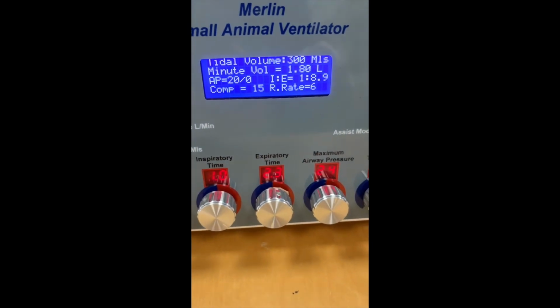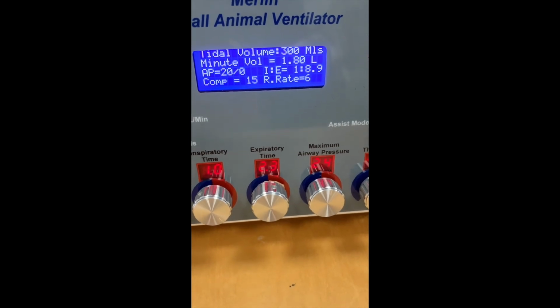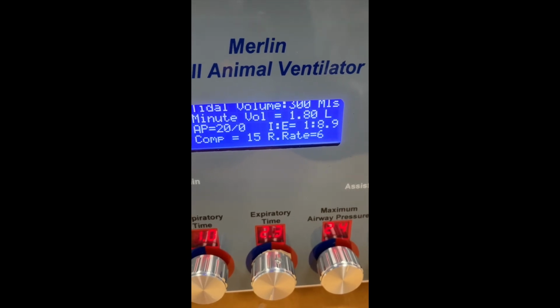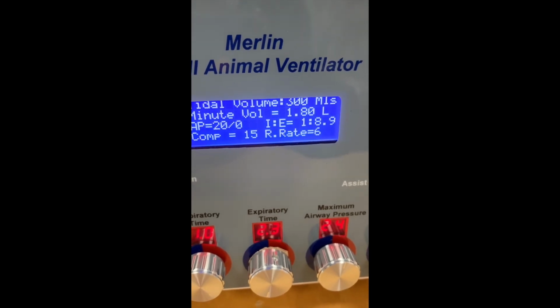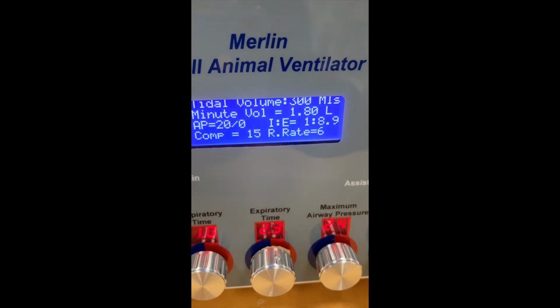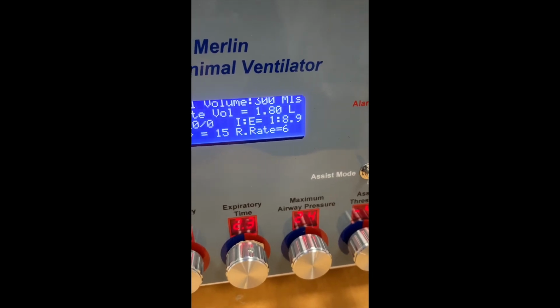Two things have happened. One is the ventilator has now stopped at the beginning of its inspiratory stroke, waiting for the patient to make an inspiratory effort. The other thing that has happened is that the respiratory rate and the minute volume have been reduced to 1/3 of their previous values. What this means is, in assist mode, that Merlin will default to 1/3 of the mandatory minute volume that was in effect before. And if the patient does take a breath, the initiated breath will then reset the timing for the mandatory breath.